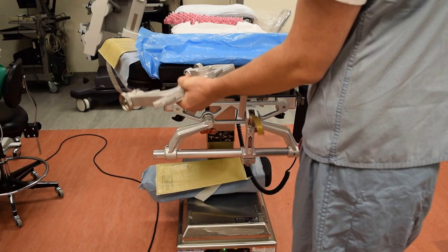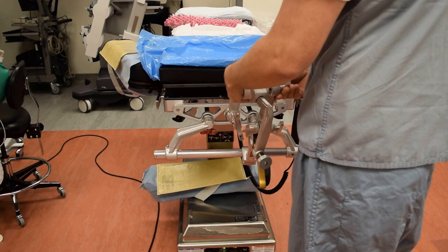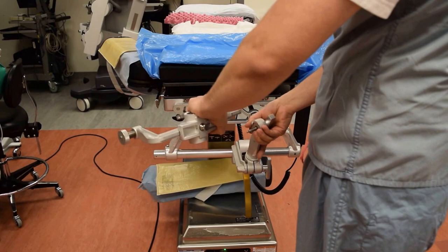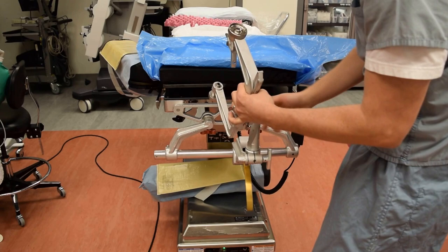The secondary person is going to come and make sure all these pieces are loose. However we want the head, we can manipulate this such that everything lines up. If you want the patient positioned like this, or flat on, we can move this over, lift this, and adjust things to get whatever position we want. We'll call this the position we want today.